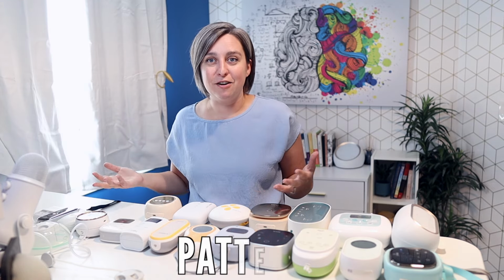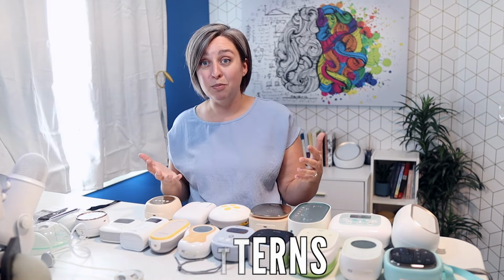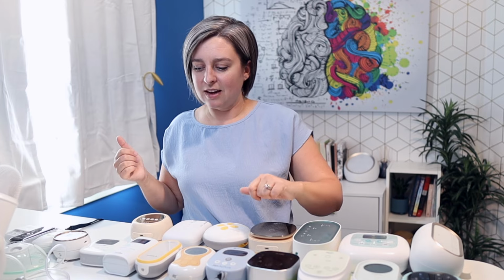And then we also have the patterns that these pumps are doing. Several of these pumps have multiple pattern styles. I believe the iCare, some of these NCVI ones as well, have different patterns. So you can do just a stimulation, you can do an expression, and then they have some alternate ones. Alyssa, I think, does as well. I'm trying to remember off the top of my head. Baby Buddha has an extra one. They have their classic Baby Buddha mode where it does like 10 bursts and then a really large one. But they also just updated it to have a more regular mode, which I was very grateful for. So some of these have different patterns for you to try to see what you respond to best, what you like, what works well for you. Like I said, that's an alternating pattern, just standard.